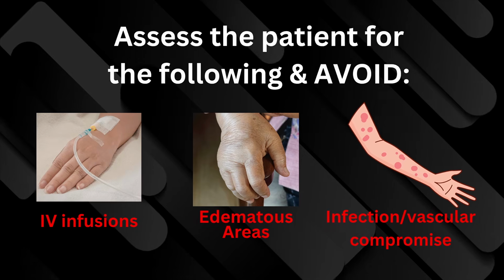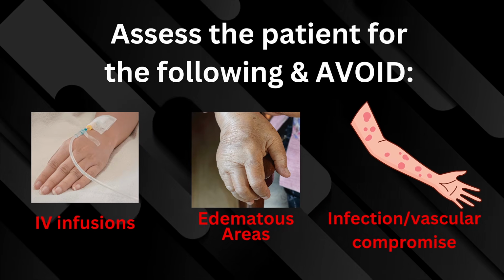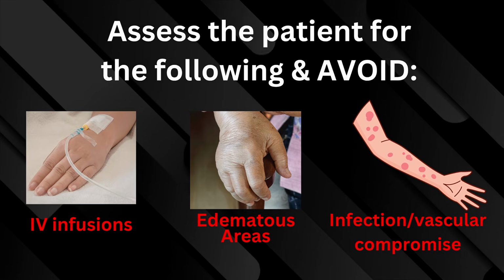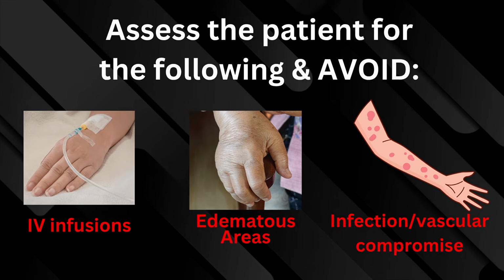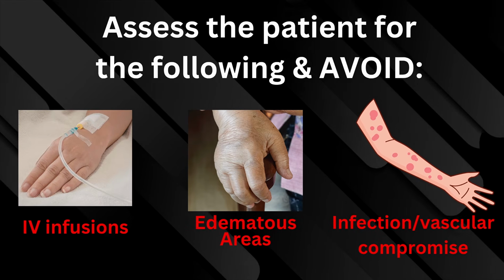Then you want to take a look at the patient. Do they have any IV infusions going? You want to avoid using these limbs. Also, look at the skin. You want to avoid areas that are edematous, have infection, or vascular compromise.